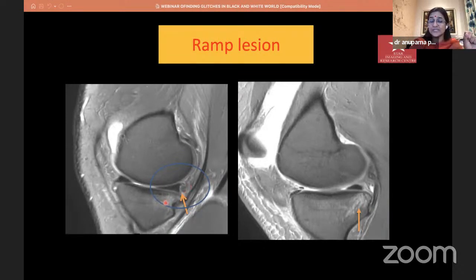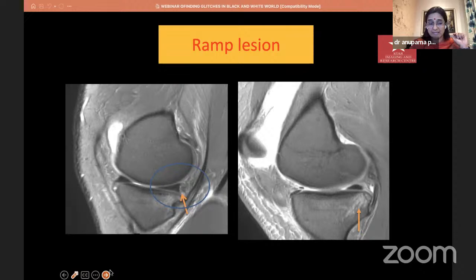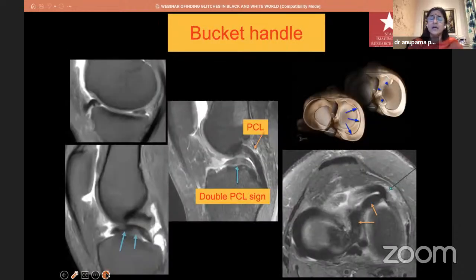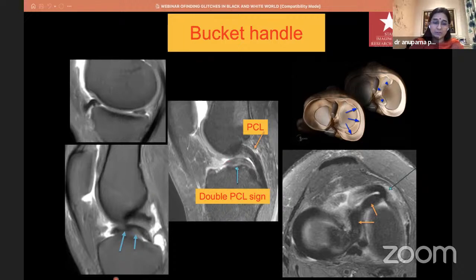A ramp lesion is a peripherally placed longitudinal tear that often gets missed. The way I look for them: look for edema in the medial tibial condyle — there is no reason for edema there unless the patient has had a contrecoup injury or the meniscus is injured. No signal inside the meniscus but signal at the capsular margin indicates a ramp lesion. Bucket-handle tears are straightforward: on sagittal imaging look for a structure just under the PCL that looks like the PCL — that is the displaced handle in the intercondylar notch.